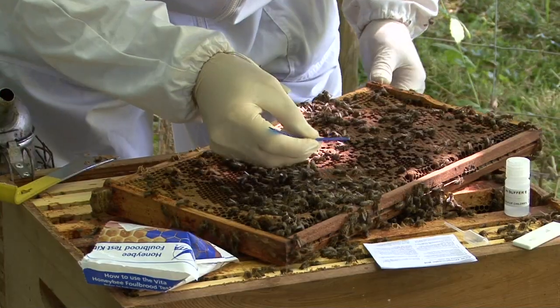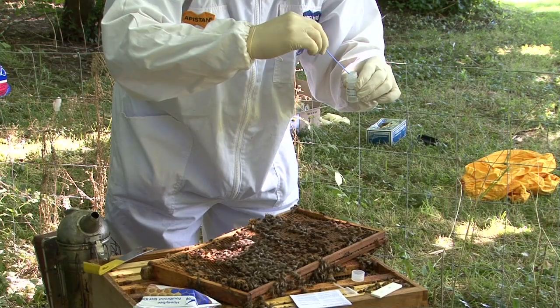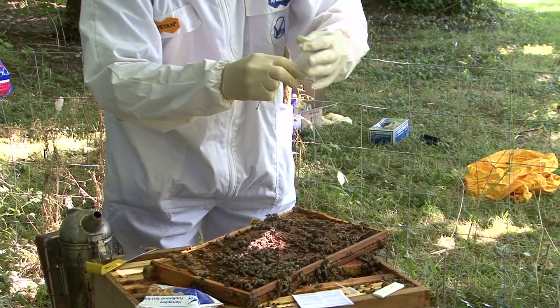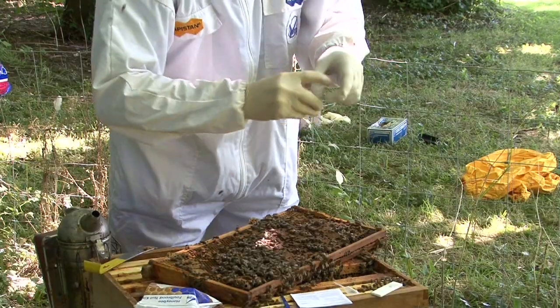Firstly, extract a larva showing suspicious symptoms with the spatula. Unscrew the lid from the extraction bottle and use the spatula to deposit the sample in the bottle. Then replace the lid and shake vigorously for about 20 seconds.